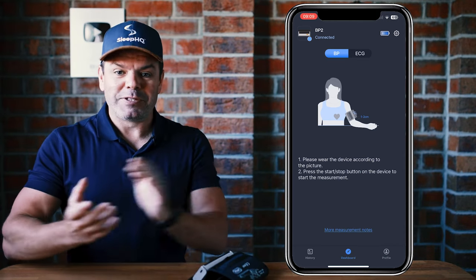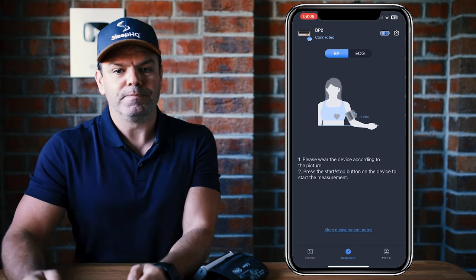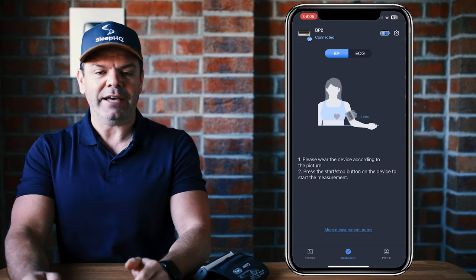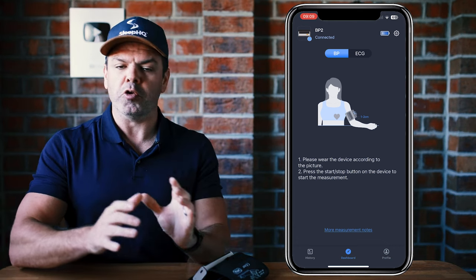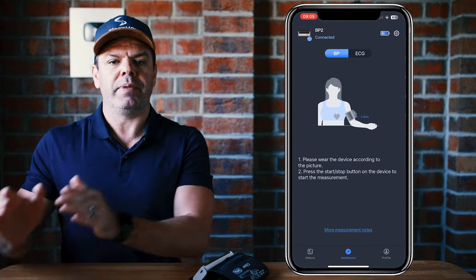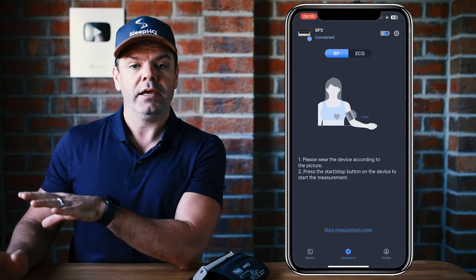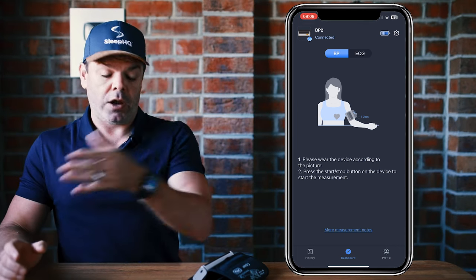The next step is to take a BP measurement. It's important when taking a BP measurement that you're nice and comfortable — sitting down, feet firmly planted on the ground, and you're not talking or moving excessively. Ideally you want to take a number of measurements at different points of the day, because your BP will change naturally throughout the day and overnight.